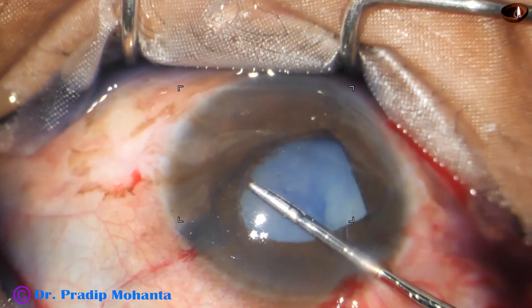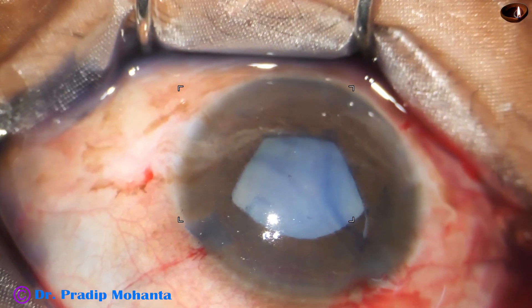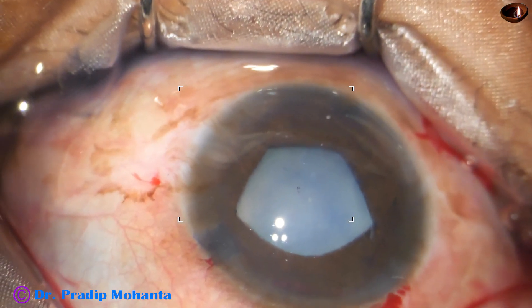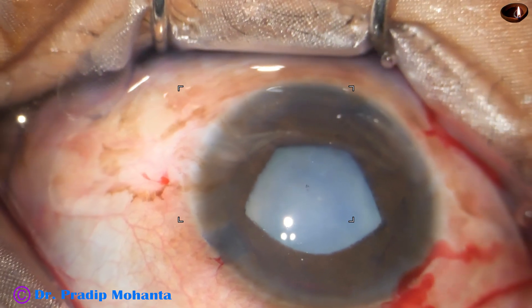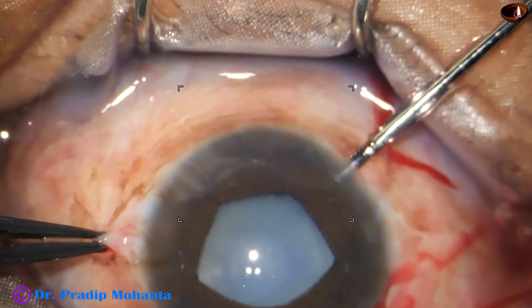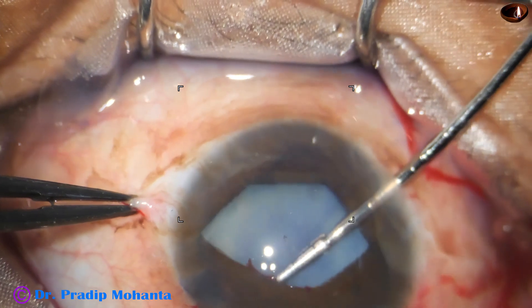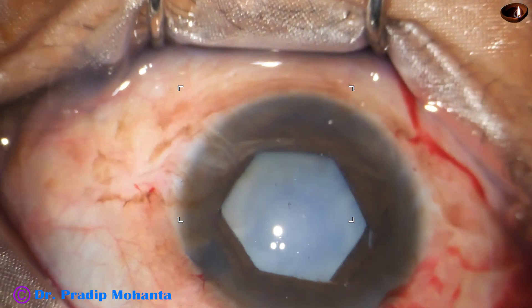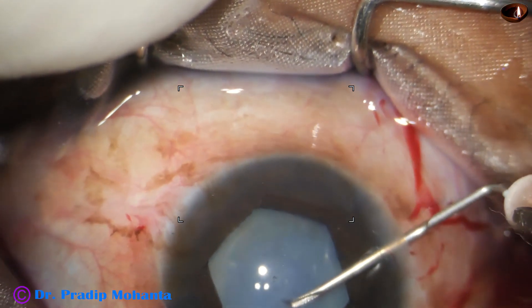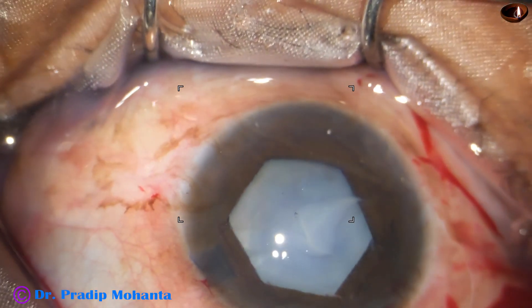A lot of trypan blue dye was under the iris and now it is coming out. The flange directed towards 4 o'clock is tucked, and now one more flange at 12:30 o'clock is approached through the incision at 8 o'clock and it is tucked. The pupil expander takes a hexagonal shape, the capsule is punctured, and milky fluid comes out.